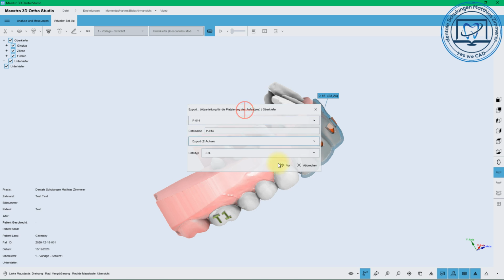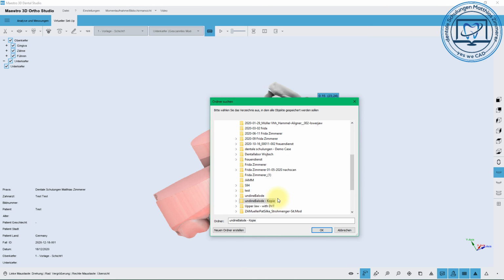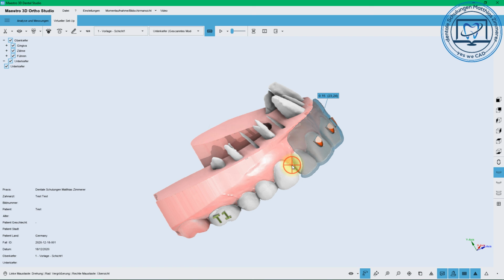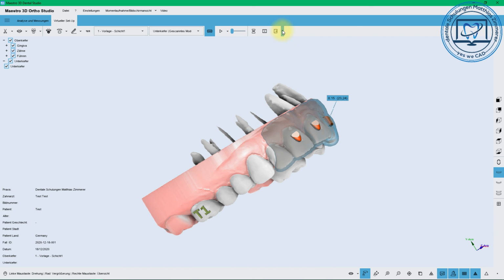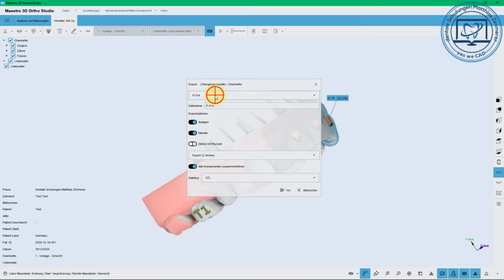Then you don't have to export the whole model setup, but at the moment I don't think there's a material for it. Something would come from Keystone, Keysplint Hard, and Graphy also have something cool, but first we have to try if it works.